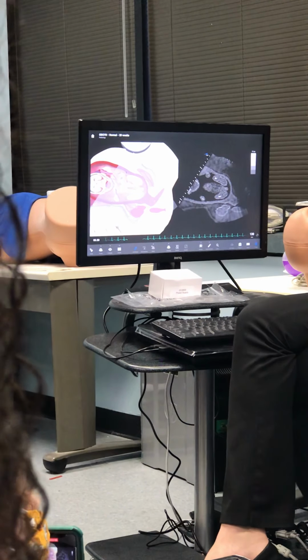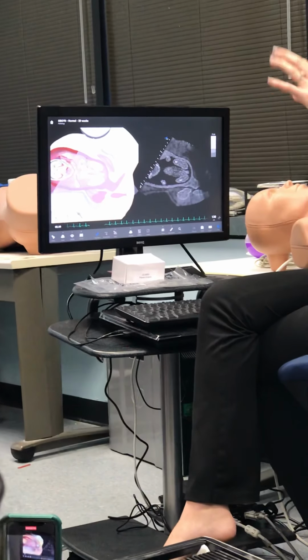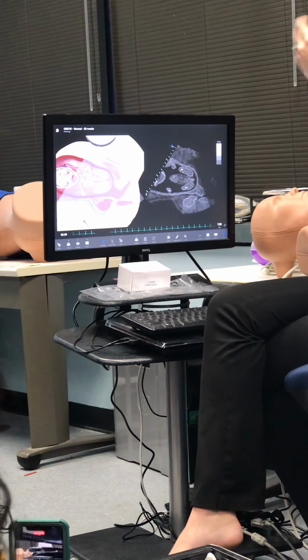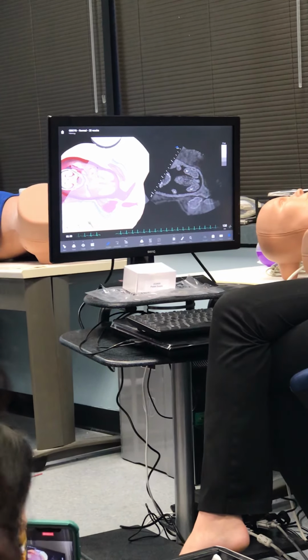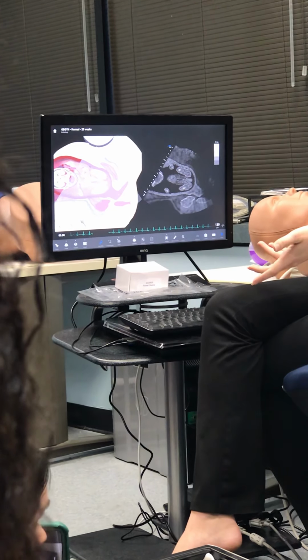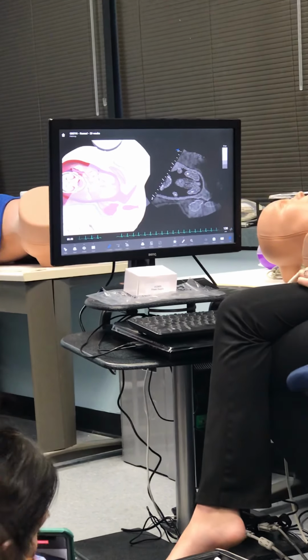you can see. Okay. Sometimes if mommy's bladder is full, demonstrating whatever anatomy is right next to the bladder is kind of a helpful landmark for you and for the doctor, just because everybody knows where the bladder is. So bladder lays pretty much right on top of cervix at that point. So whatever is right there, you just kind of take that.